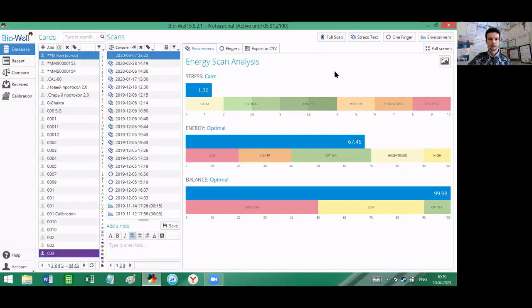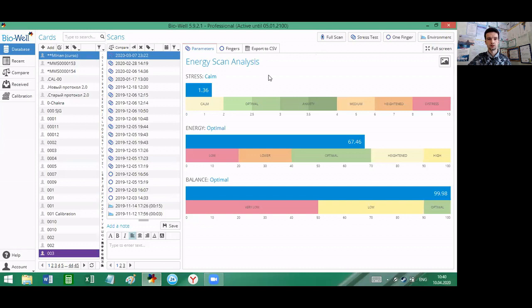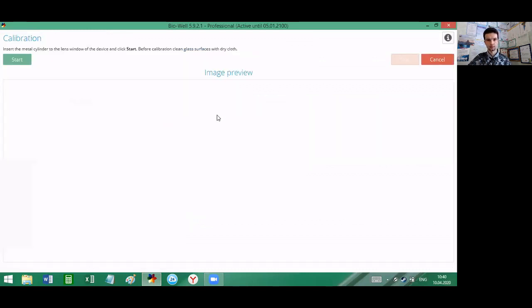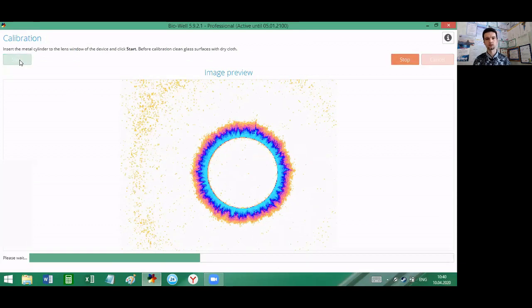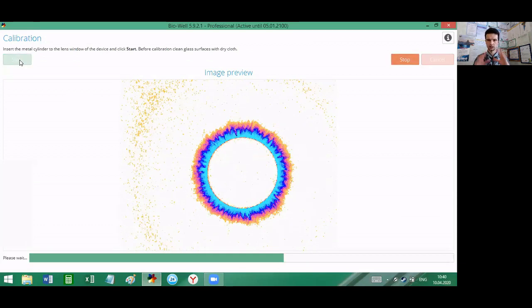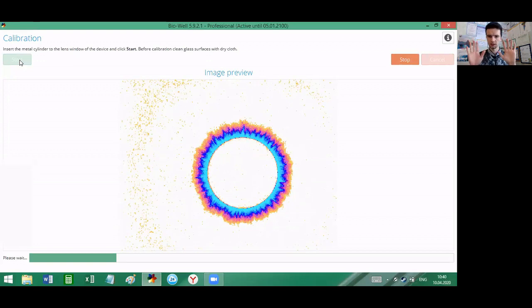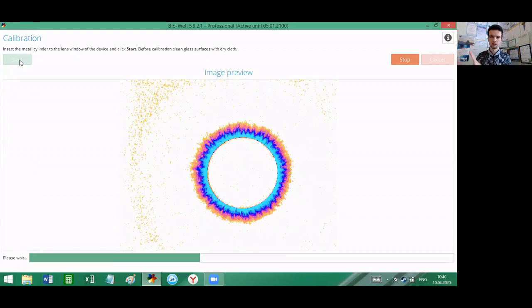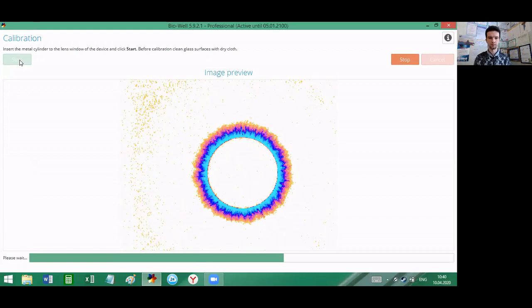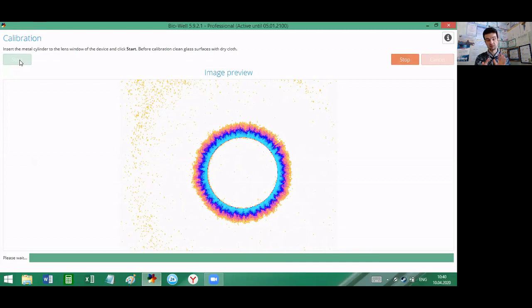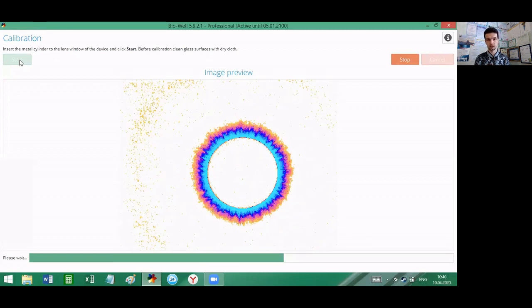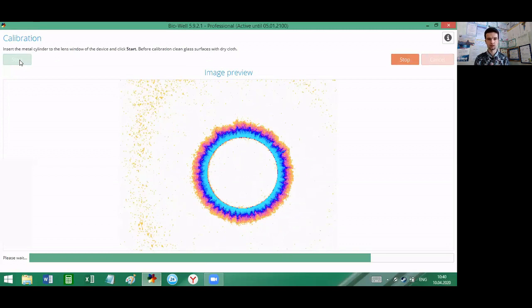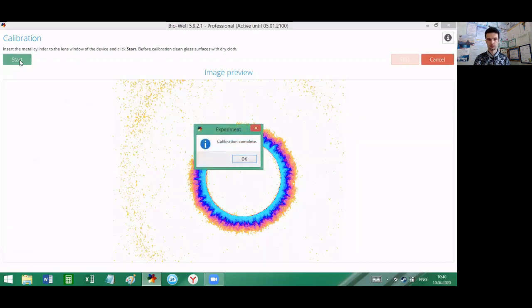We will use the Biowell device, this one. It's ready for calibration now. Calibration is needed for tuning the parameters of the device and software to the environmental conditions in which we work. I go to calibration and click start. Now the device will do the calibration itself. You don't have to touch it. You just put it there and within less than 20 seconds it will finish the calibration process. It's done and we are ready to go.